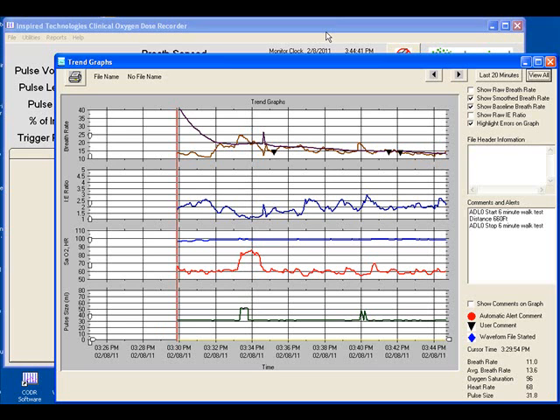As a side note, we can see here how SmartDose works. This shows a patient who was at rest and then briefly got up and walked around. We can determine this by the rise in heart rate, the rise in breath rate, and the decrease in IE ratio. Notice that the SmartDose oxygen system increased the oxygen at exercise to keep up with the patient need. Notice also that it automatically decreased again when the patient stopped exercising.